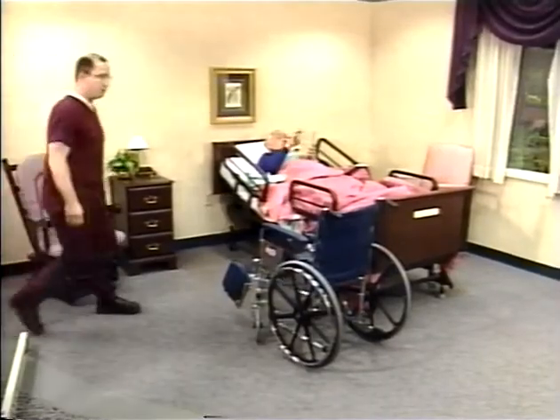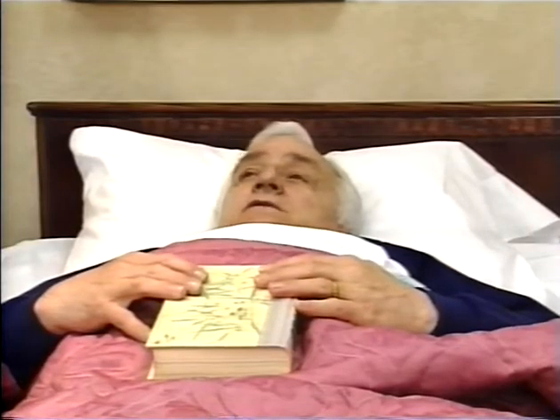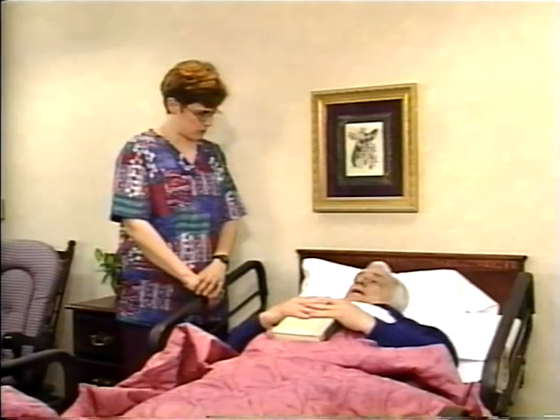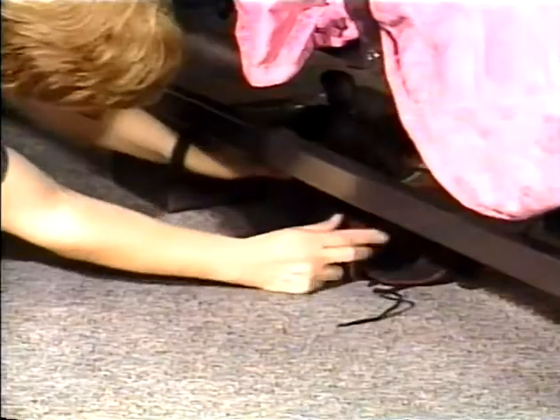Always begin by planning your lift before proceeding. You'll want to evaluate both your environment and your passengers' needs. Go over the lift in your mind from start to finish before you begin. Make sure you have a clear path from where you are to where you want to go. Take time to clear the path if necessary.